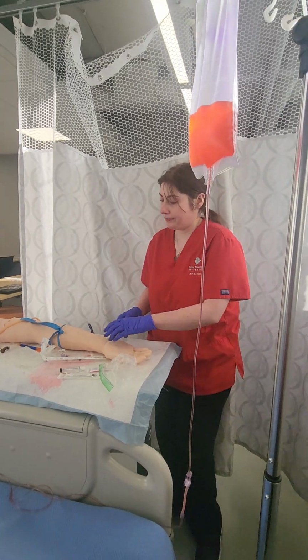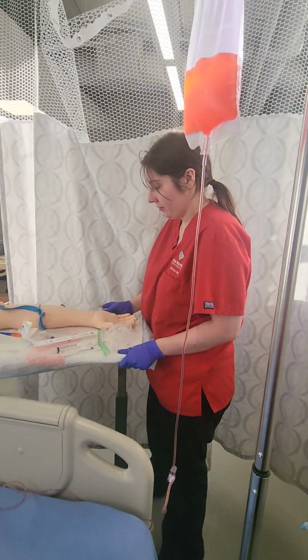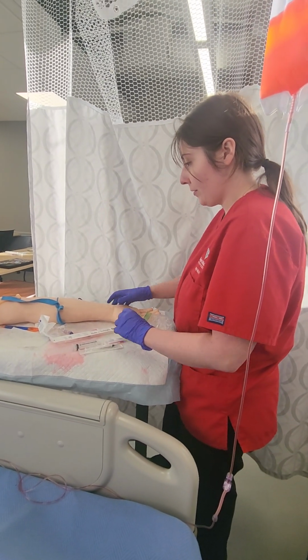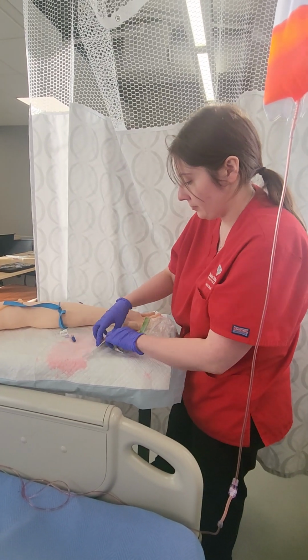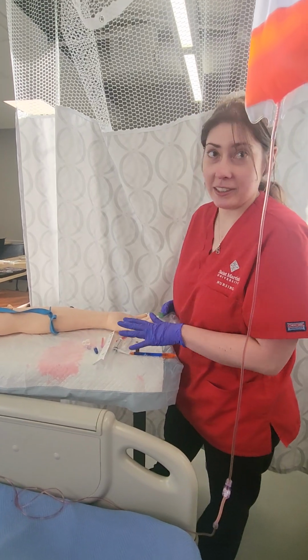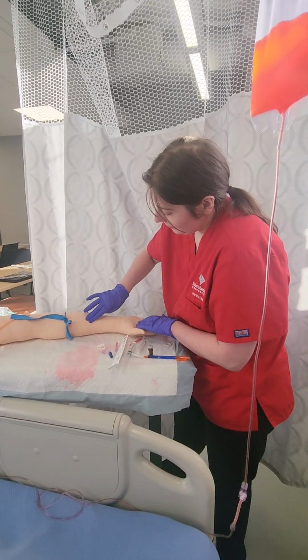Okay, Scott. I feel like I should have this here. You can see everything really good? Okay. So I'm feeling, I feel that.